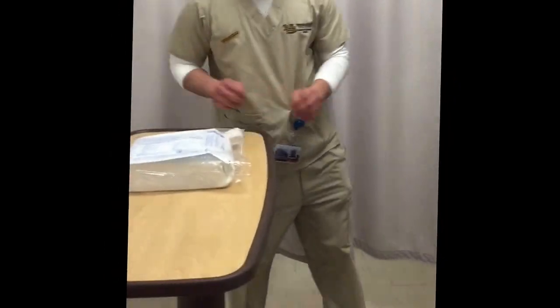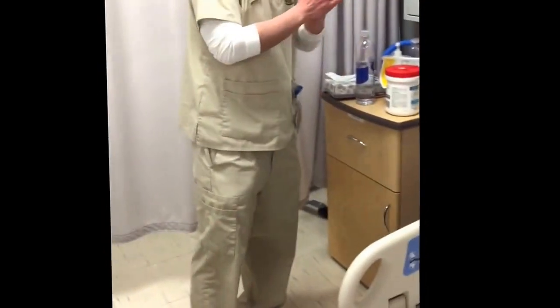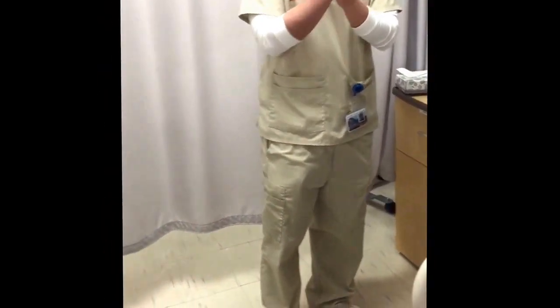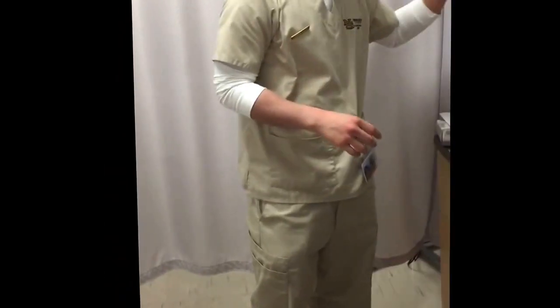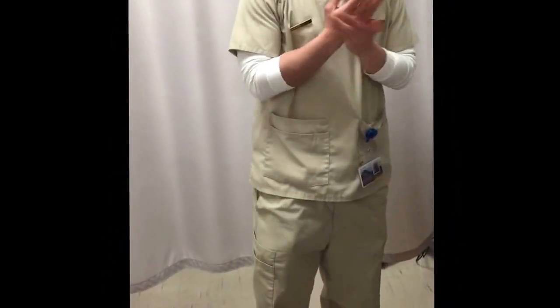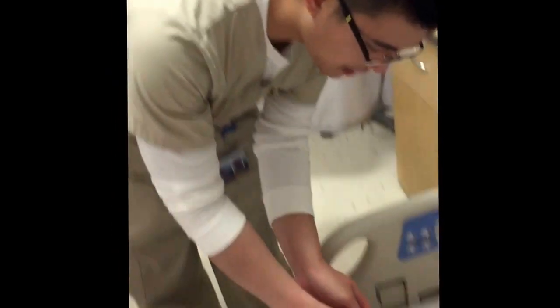Hello, my name is Michael Arduin. I'm a student from Nevada State College. Can you please say your name and date of birth for me, please? Yes. Susan Smith, January 1st, 1960. Alright, Miss Susan, let me just double check that on your wristband.